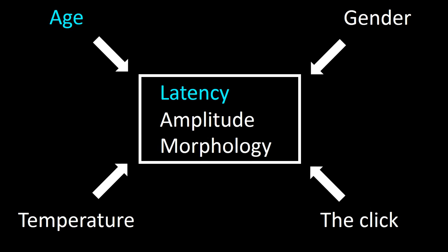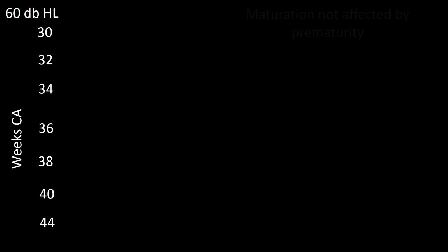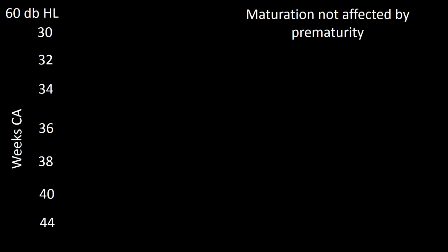Age affects latency. The studies in neonates were done using clicks with an intensity of 60 dB hearing level, using conceptual age, going from the time of birth all the way down from 30 weeks conceptual age to 44 weeks conceptual age.